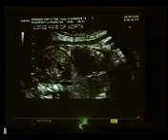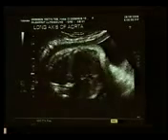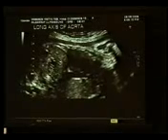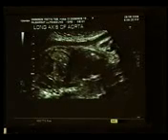So you will see a slit-like echogenic structure, an echogenic line in the center, meaning the valves are there, and that's the long axis view of the aorta. So we have talked about the importance of the long axis of the aorta, and that's how it would look. Now we move on to our next scan.